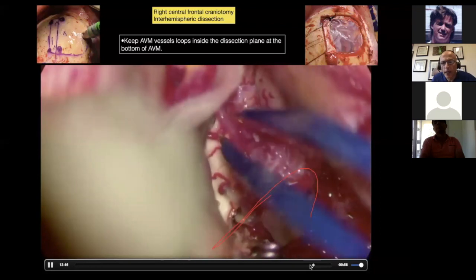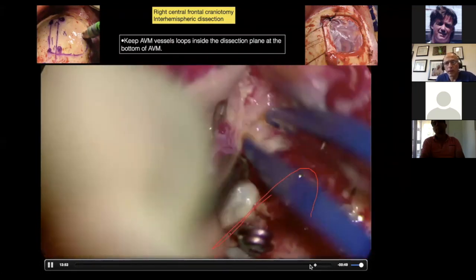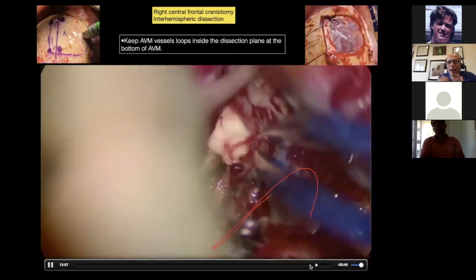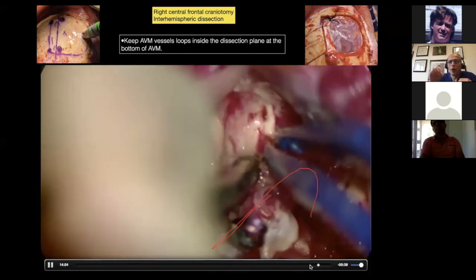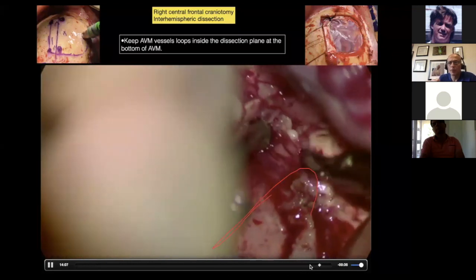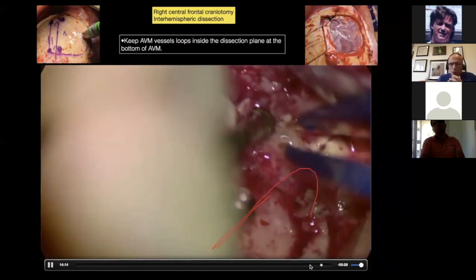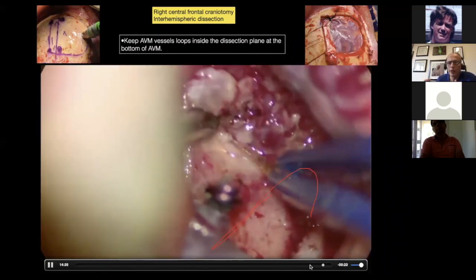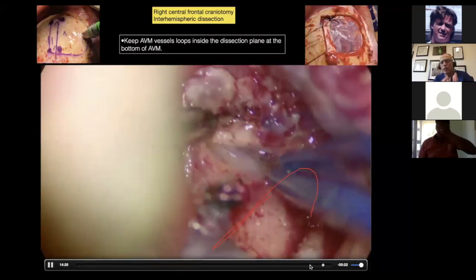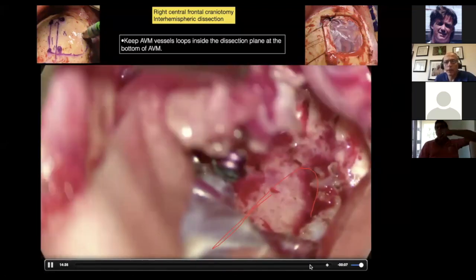And I didn't use any embolization. Embolization in these straightforward AVMs makes the surgery more difficult. It doesn't make it easier, okay? And plus, I'm taking the feeders by direct inspection. So only use embolization when it is absolutely necessary, like perinidal aneurysms, or if you think taking the perforator at the very deep is going to help you. But in general, I'm telling you, I moved more and more towards no embolization over the years, because I think embolization doesn't help a lot and increases the difficulty of the surgery.